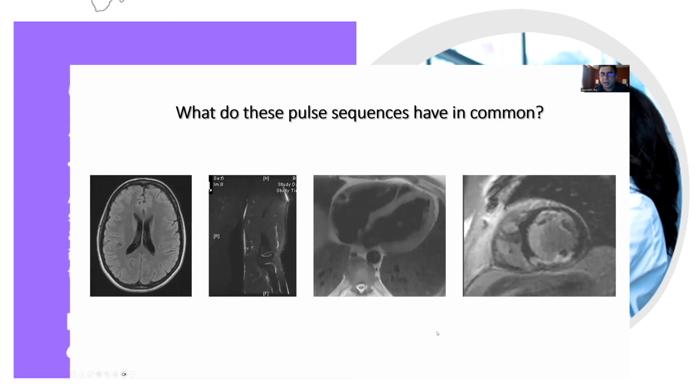All right, so now I've explained something to you. I've explained that for angiographic contrast, you want the wall to be different from the moving blood, which can be done in one of two ways: by the inherent property or by the fact that the blood moves. I also showed you an example that sometimes blood doesn't move fast enough, and therefore you can't always rely on the movement of the blood to create that angiographic contrast. So how else do you do it?